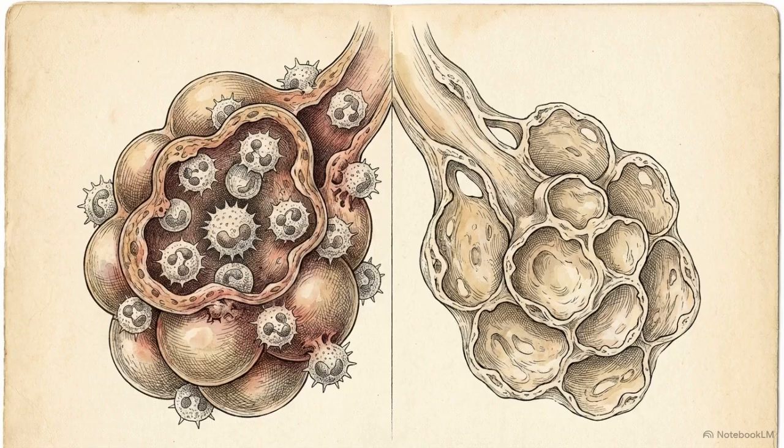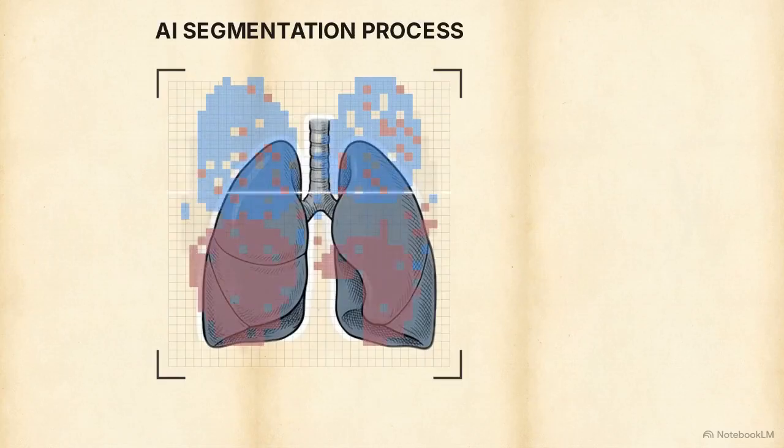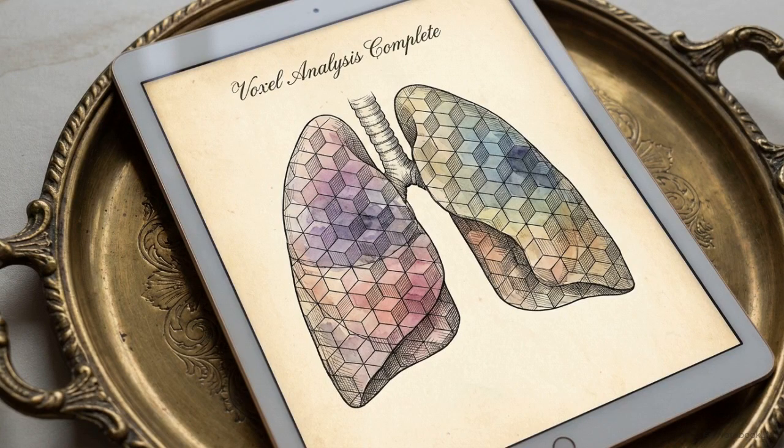Deep learning models are currently being trained to automate the segmentation of these specific patterns from raw CT data, removing subjective bias and enabling rapid subphenotyping directly at the bedside. Integrating voxel-level imaging data into clinical models represents the current objective for ARDS precision medicine.